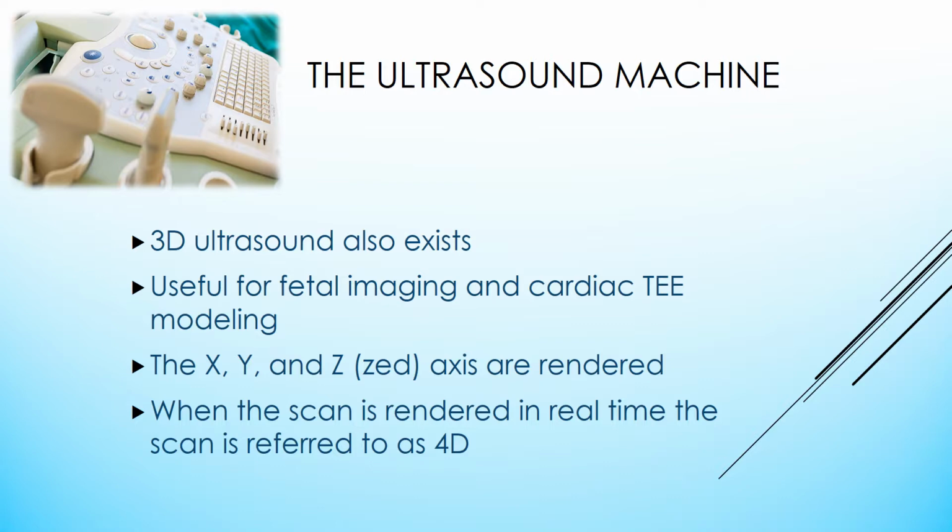3D ultrasound also exists, useful for fetal imaging and cardiac TEE modeling. The X, Y, and Z axes are rendered. When the scan is rendered in real time, the scan is referred to as 4D. I must go on to say that 4D interrogation of cardiac valves absolutely rules. This technology uses 2,000 to 3,000 crystals in a 2D phased array.